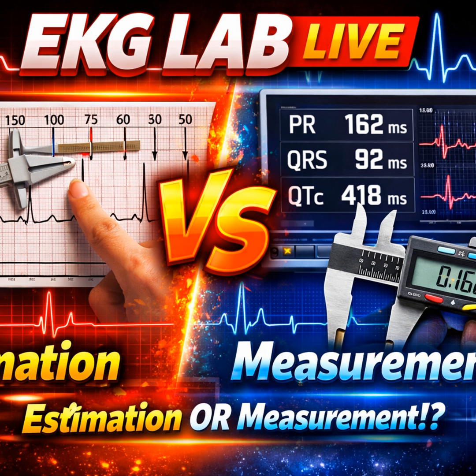You mean the 6-second method? Exactly. You take a 6-second strip, you count the R waves, and you multiply by 10. It is practical, it handles irregularity effortlessly, and it keeps your eyes on the rhythm, not the grid lines. If I count 8 beats in 6 seconds, the rate is 80. Done. I don't care if the RR interval varies by 0.08 seconds. I know the rate is controlled.